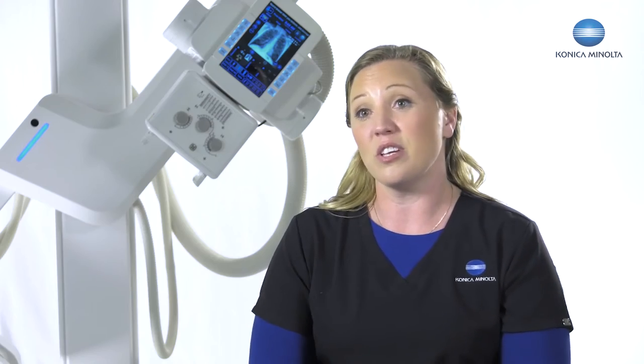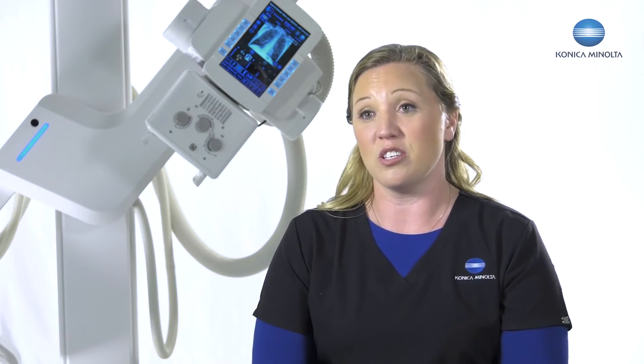I'm so excited about this stand. It's been two years in the works and there are so many things I can customize to every facility exactly how they want their machine to work. I can put an unlimited number of positions into the stand on the fly while doing applications. It's just making the facility better for more patient comfort and a better clinical experience.